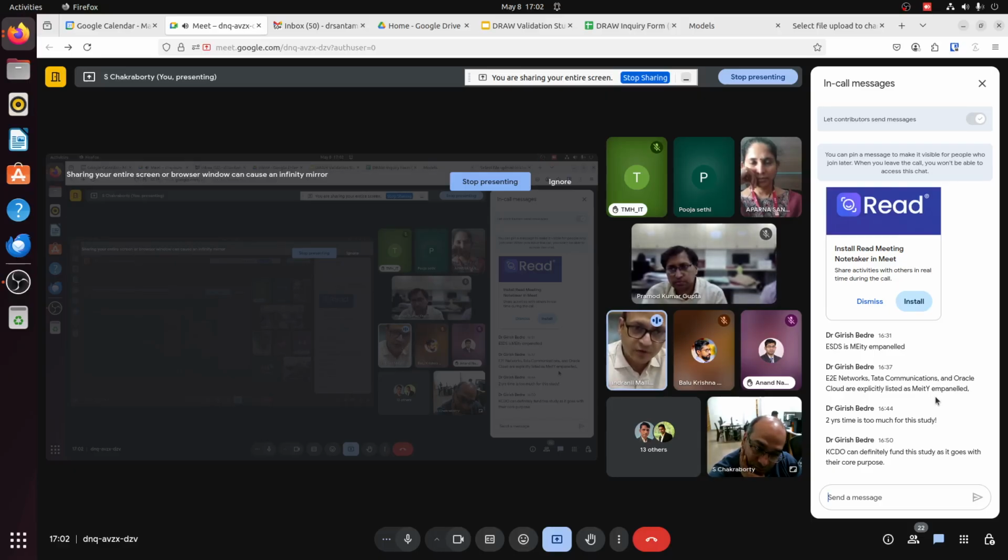But then what you'll have to do is, once it comes back and pushes the structure set file back into that particular folder, your physics team will then have to manually copy it back or import it from this folder. So it will be more manual work for your physics team. But if that makes them feel safer, then absolutely that is fine with us.